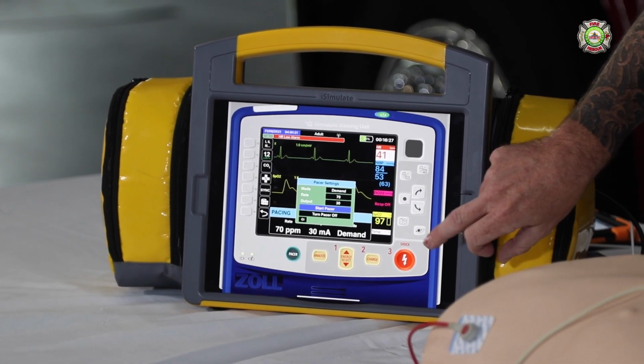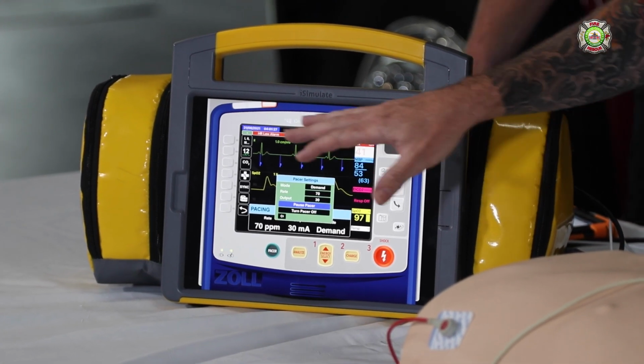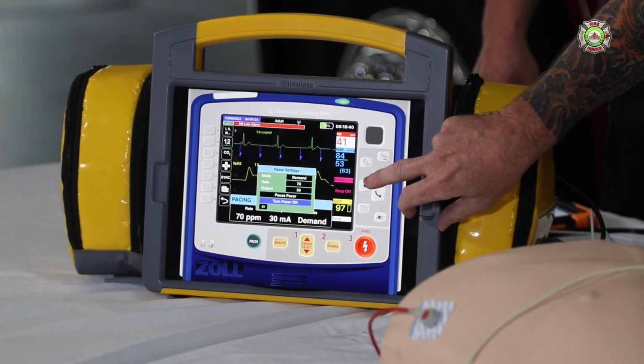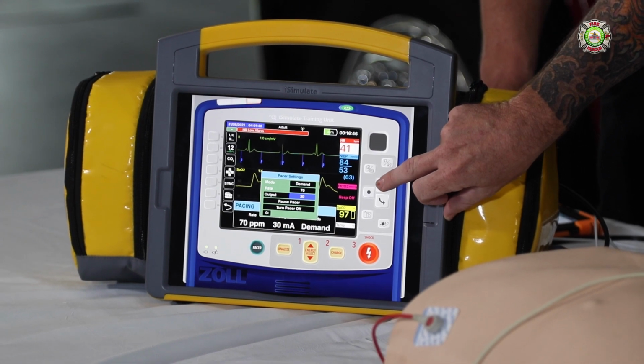So we're going to start our pacing. And now you can tell we're pacing. We do have pacer spikes. So now we are looking for electrical capture. So we're going to increase our output until we see capture. We're going to go up by 10.